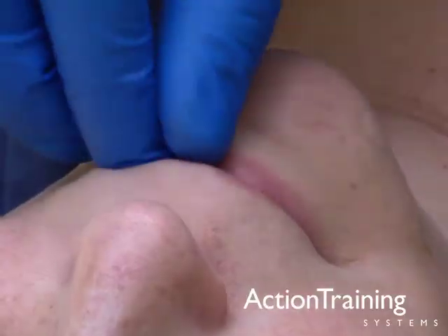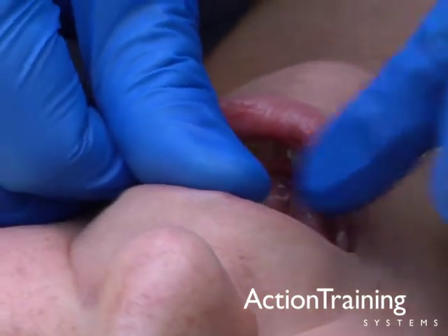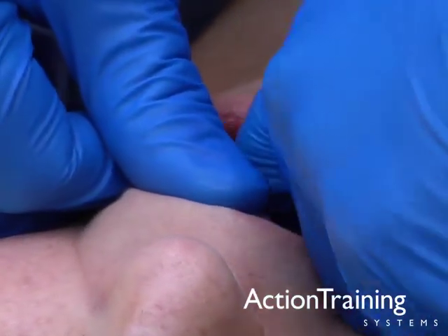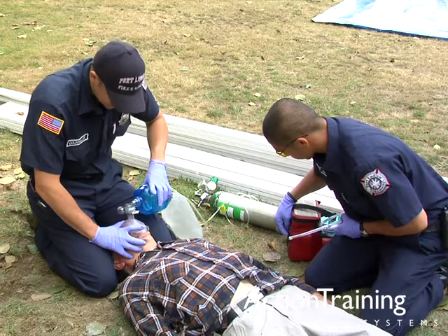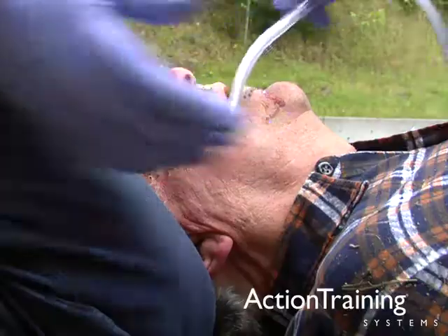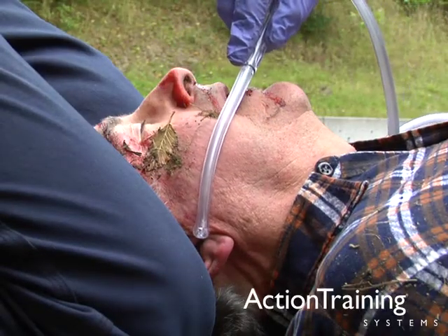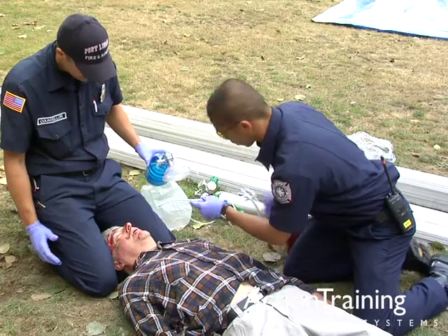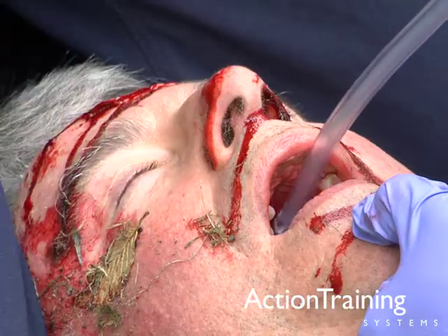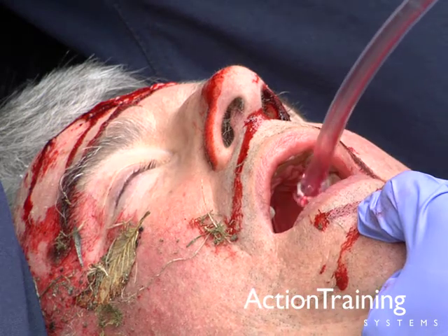You have seen how to clear an airway using the finger sweep method to dislodge foreign body obstructions. And you have seen the steps for performing upper airway suctioning, including how to measure the suctioning catheter, when to use it, how to test its operation, and how to perform suctioning without damaging soft tissue of the mouth.